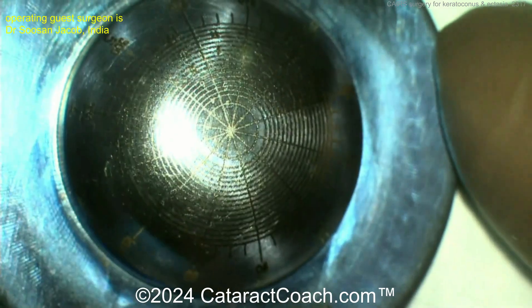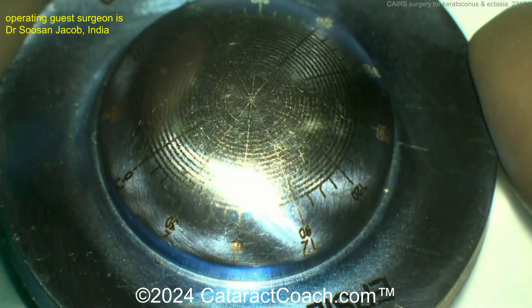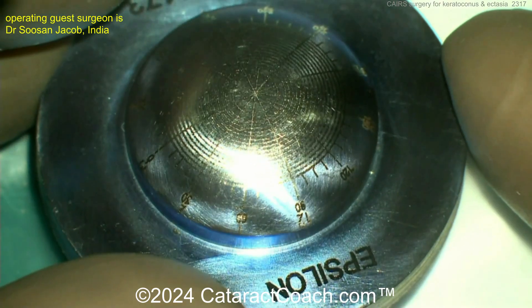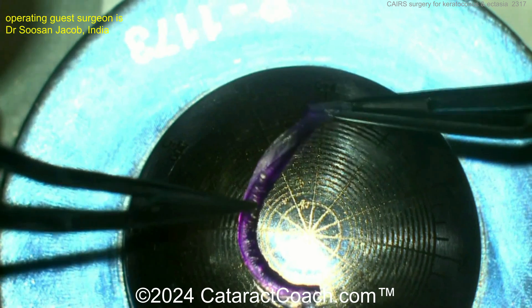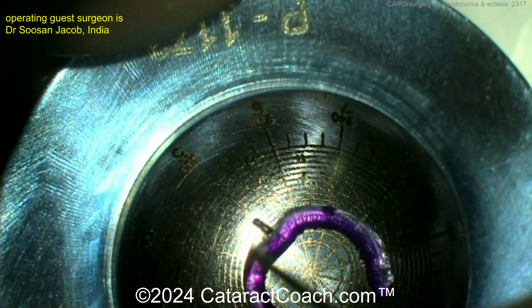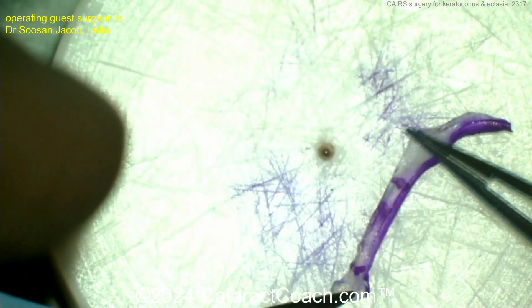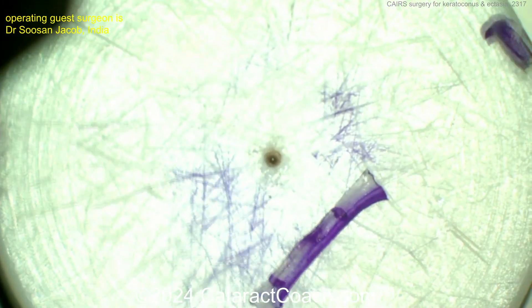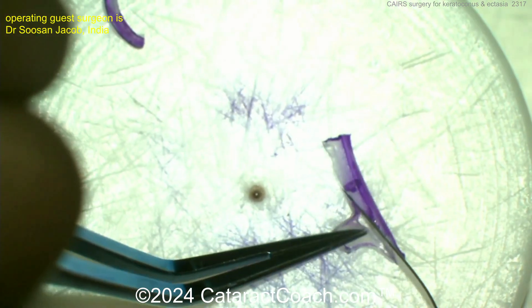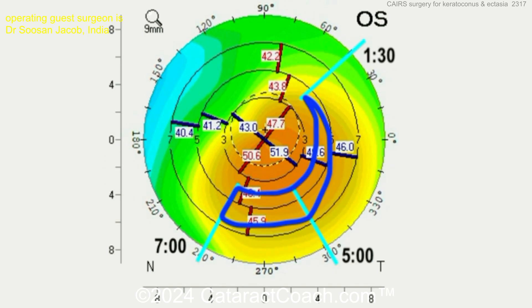Now putting it on a degree gauge — this is a very exacting thing, and I'm sure there's a nomogram to plan this out. You can see this epsilon surgical degree gauge where you place the tissue and determine the appropriate size, marked off in clock hours, to determine how you want to place it. That's the allogeneic tissue that's going to be grafted into the patient's cornea — a hand-cut design shaped to bolster this area.